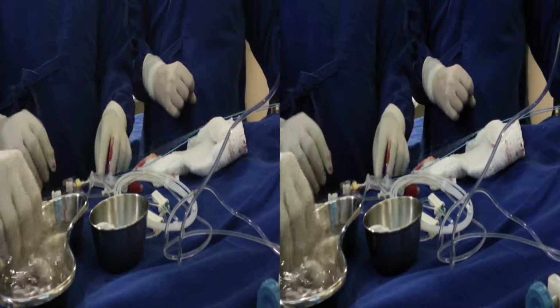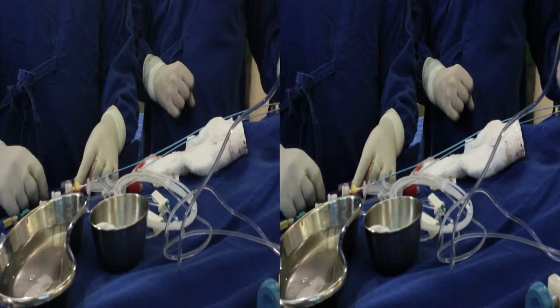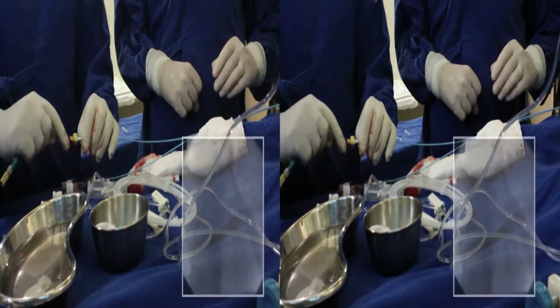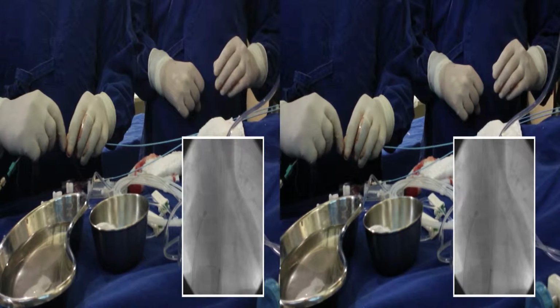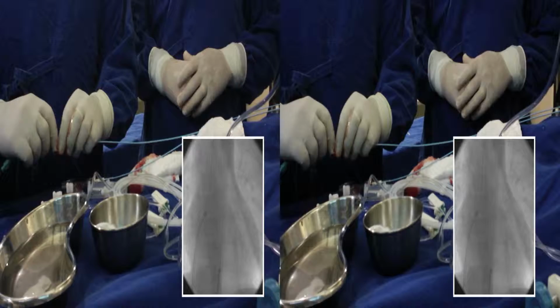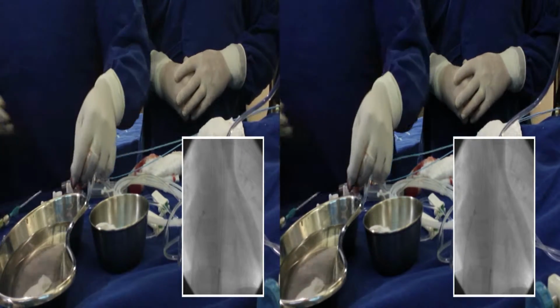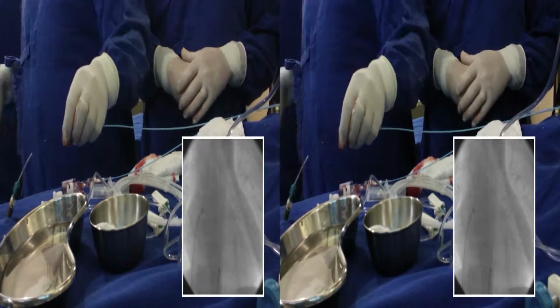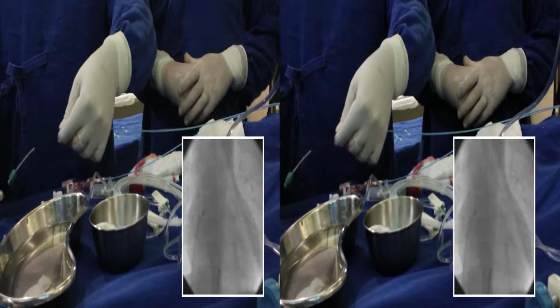This catheter is through the artery, and this guide we snared and pulled into the femoral vein, forming exactly the image resulting in a rail, as we can see. This catheter is placed into the aorta and the other one is exactly into the fistula, through which we sailed over that rail.